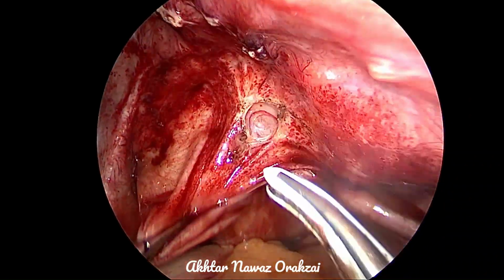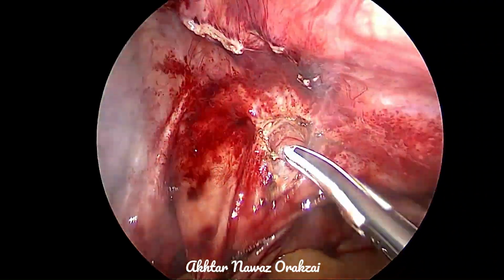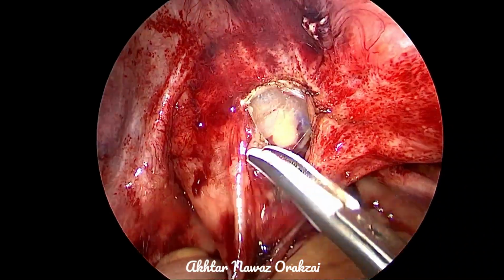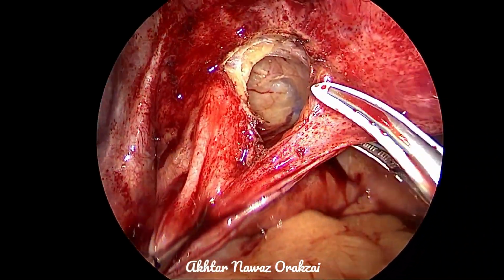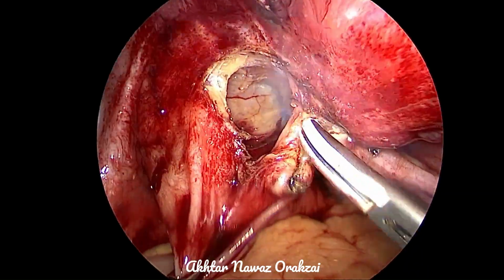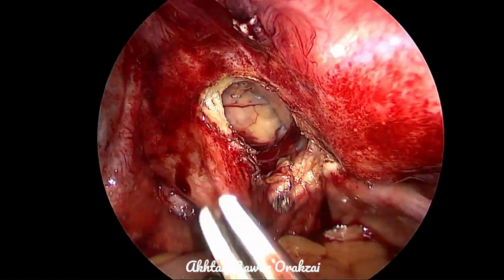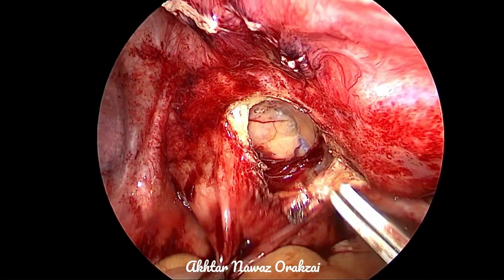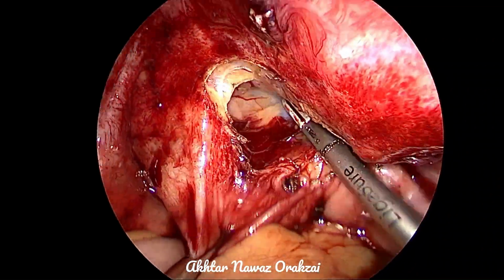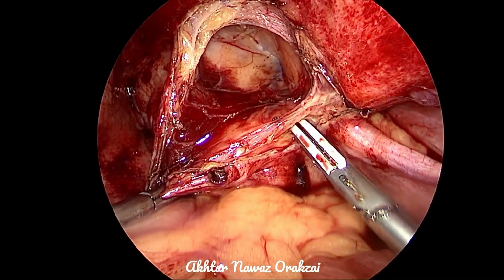Now comes the mobilization of the bladder. As in laparoscopy, we need to bring down the bladder and apply 1 or 2 stitches to the extravesical tissue on the Psoas muscle, so that during the repair the bladder does not go away from us and is relatively static, so that a good repair and anastomosis can be performed.